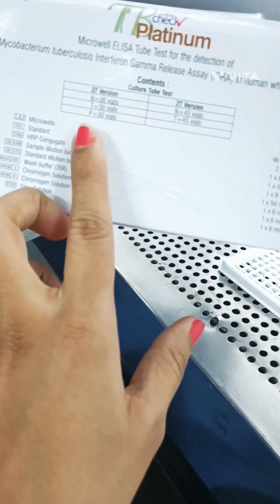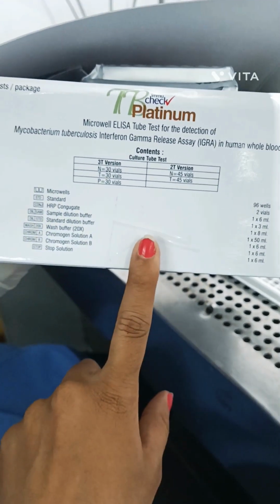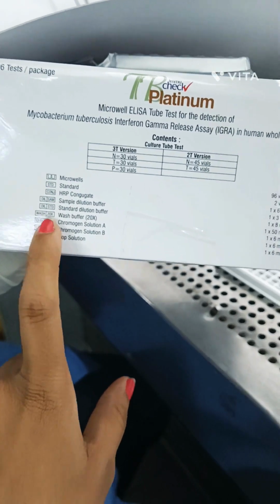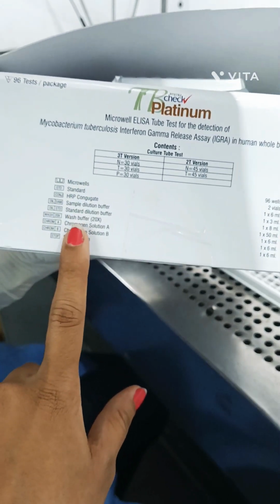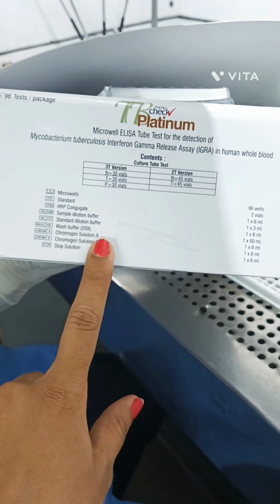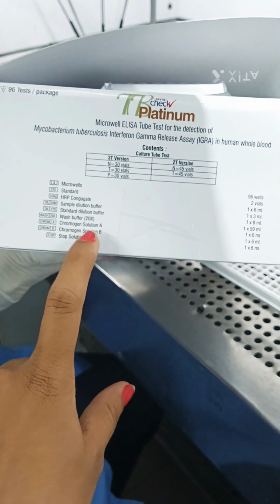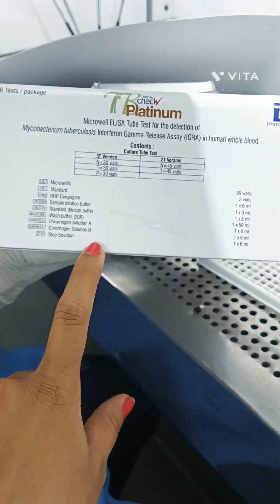In that we have microwells, standard, HRP conjugate, sample dilution, standard buffer and wash buffer, chromogen solution A, chromogen solution B and stop solution. So let's get started.